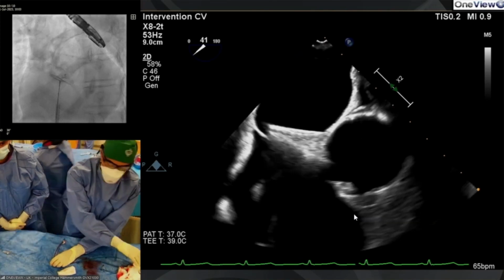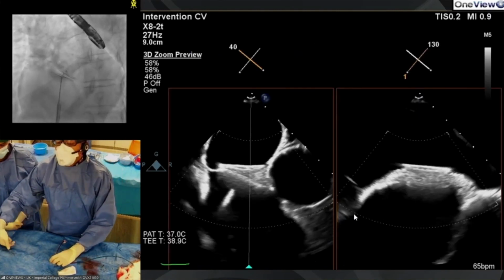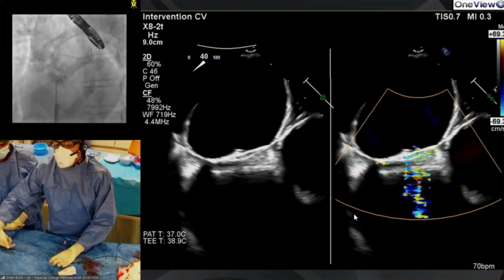Well, Neil and Bushra, you made it look really simply and beautiful and easily. We have a request from the audience asking if you guys can lower your color gains to see if there's anything else in the lower velocities. Okay, we can do if you like.